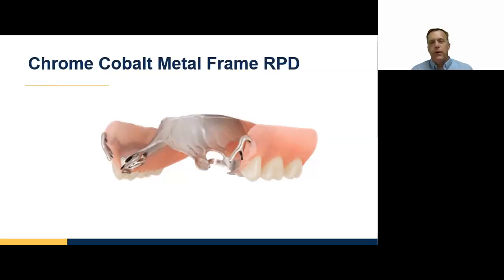Although the metal clasps are not as pretty, and there are a lot of patients that just don't want metal today, we do have options for those patients. But I would say, don't overlook your metal frame partial. There's a reason it's been around for almost 100 years: it's a versatile and reliable option.